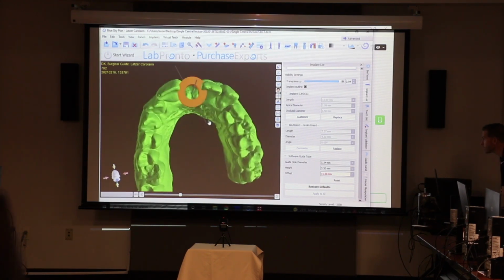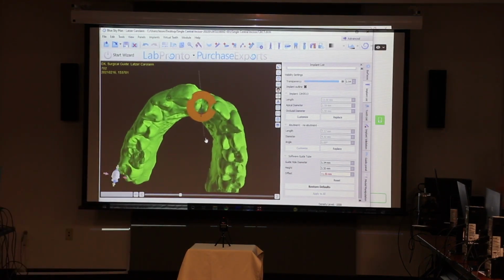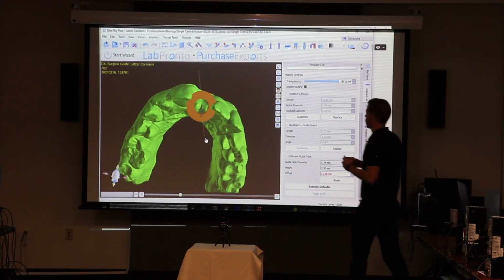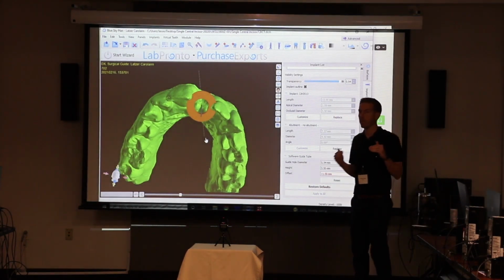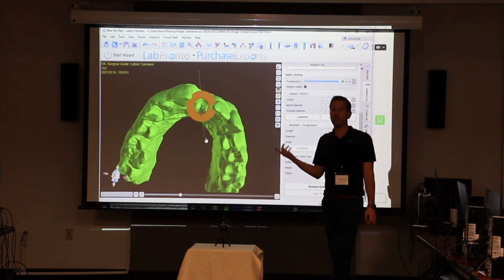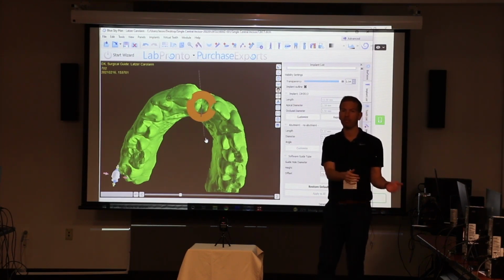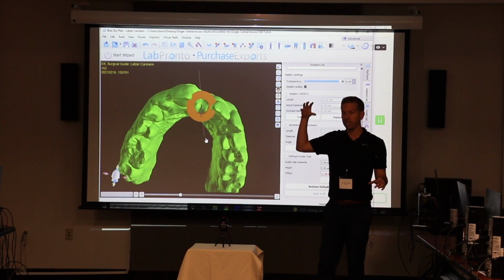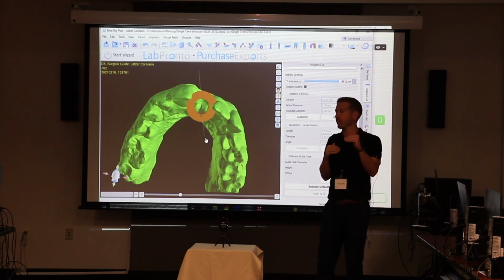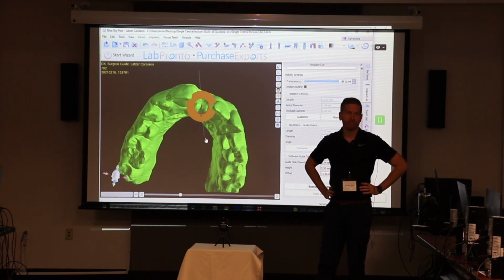Now I've got all this plastic that's going to be guiding my drill. So we went from 8.5 sleeveless and we bumped it up 3 millimeters to give us 11.5. And now we would take a 16 millimeter drill and hub it out. That's going to give us that proper depth. And then we would take our 13 millimeter implant and we would sink it through the guide tube to an offset of 11.5. Is that confusing? Cool. I think that's kind of confusing initially.